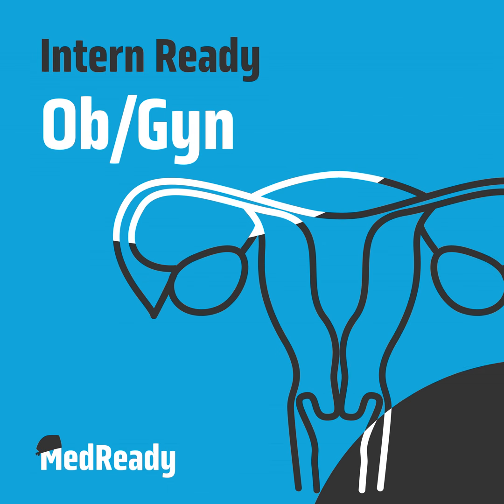Yeah, so we can talk a little bit about going from outside to the inside as you're thinking about complications. From the start of hysteroscopy, when you're just starting to place your speculum and tenaculum, the things that we think about are, one, of course, infection. It's rare, actually, with proper technique. Usually in a hysteroscopy, we're not using antibiotic prophylaxis. Right. And that's because everything is contained in that non-sterile space that you're in when you're performing a hysteroscopy. But that's always something you think about.